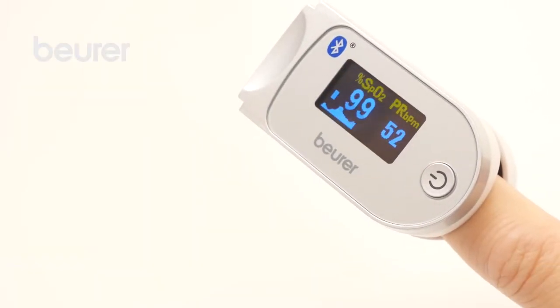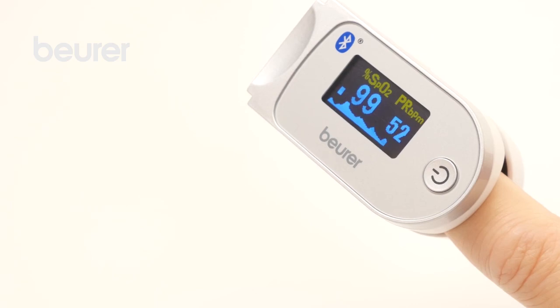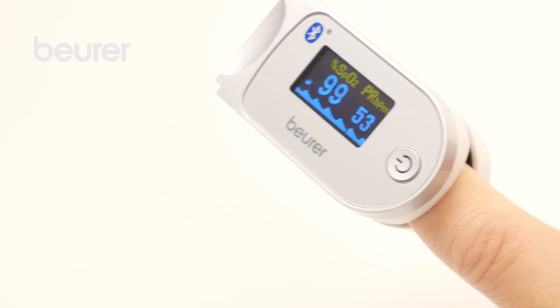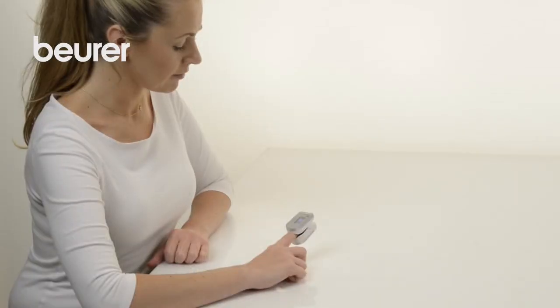The measured values will appear on the Pulse Oximeter display after a few seconds: oxygen saturation, pulse frequency, pulse wave, and pulse bar.